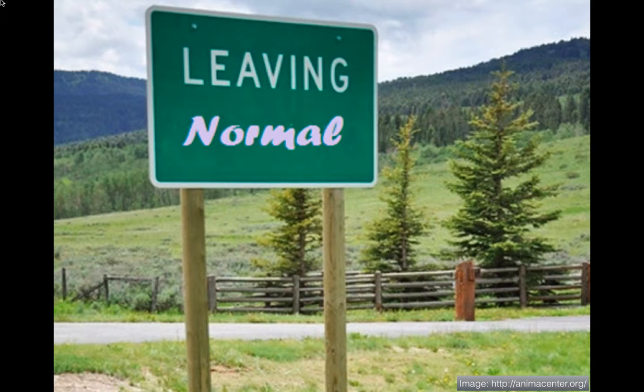Now that we've defined normal structure and measurements, let's talk about the abnormal images that you might find in a patient with real pathology. As mentioned earlier, the abnormal things that we are looking for include gallstones, a sonographic Murphy's, as well as pericholecystic fluid, gallbladder wall thickening, and common bile duct dilation.